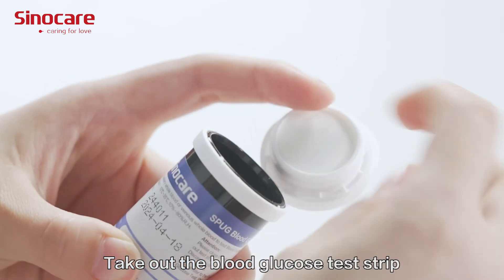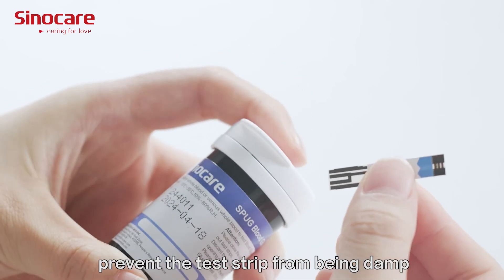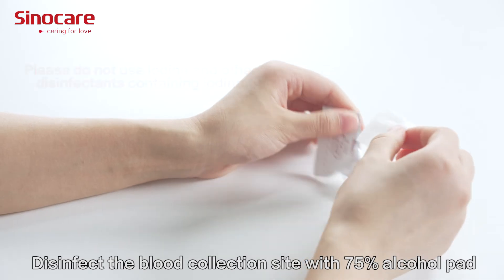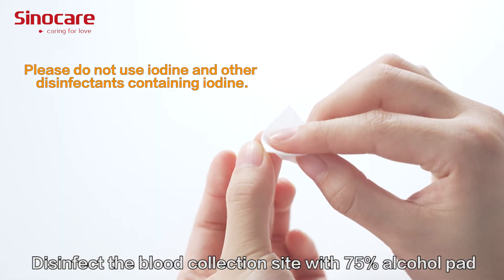Take out the blood glucose test strip and cover the bottle cap immediately to prevent the test strip from becoming damp. Insert the test strip into the test strip port on the meter. Disinfect the blood collection site with a 75% alcohol pad.